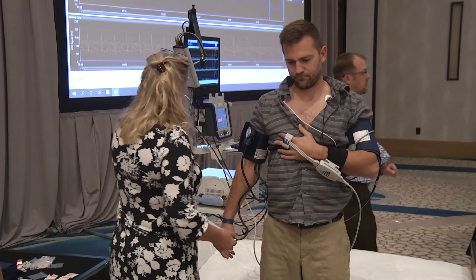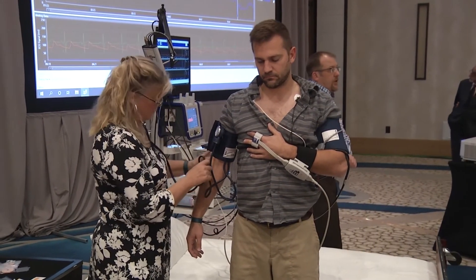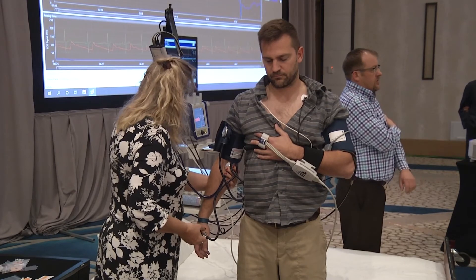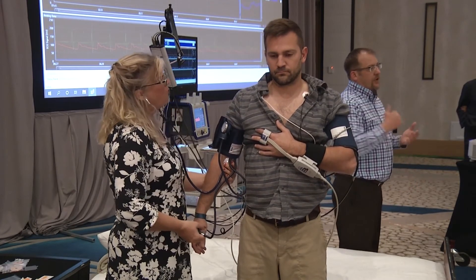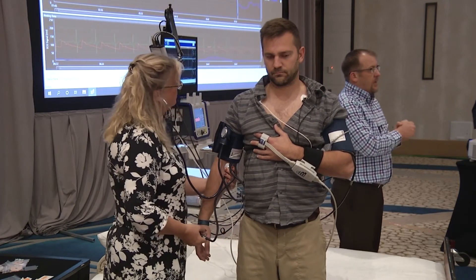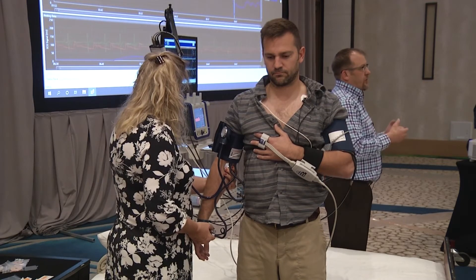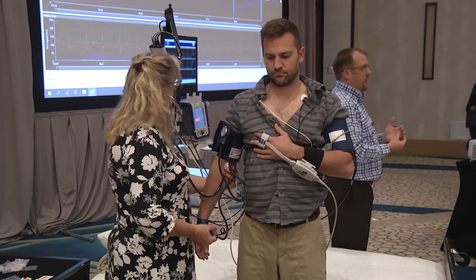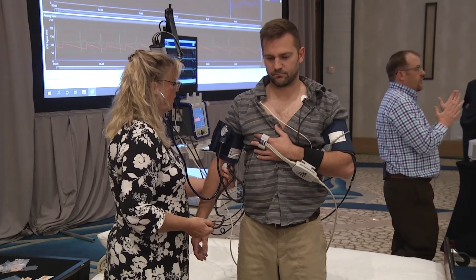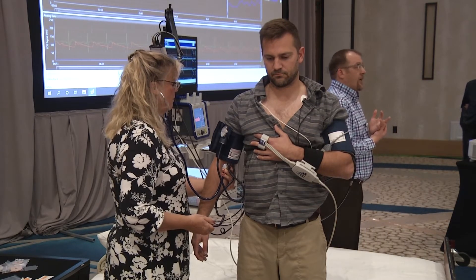He had a really high blood pressure coming in, and we knew from the manual that it wasn't accurate. It's likely due to vasoconstriction from the cold, and most of these blood pressure devices are very sensitive to vasoconstriction. That's where warming solutions come in — rice packs, water heaters. I've actually used exam gloves with a little heater in the palm, and these devices will read through a standard latex glove.